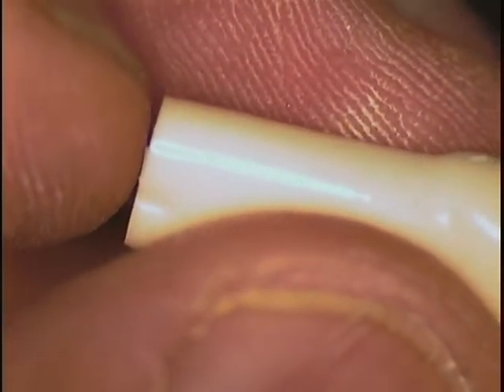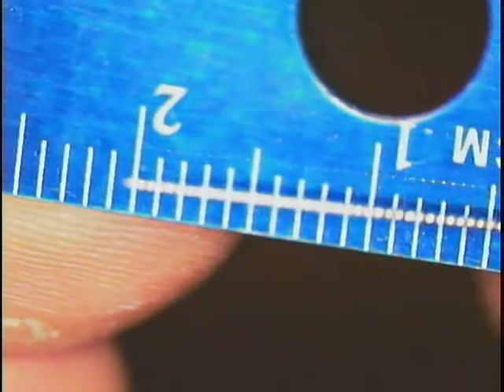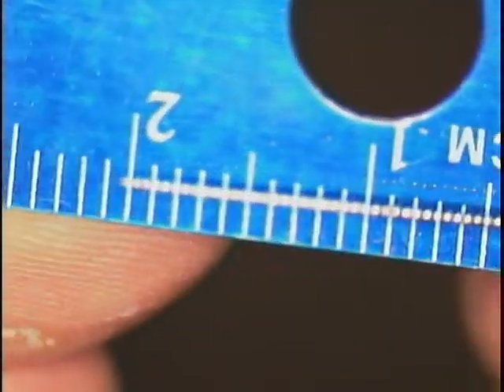Okay, so I'm out the end, I pull it back, I measure it, that's my mark. I take my ruler, and I'm on the metric side, right? And I'm going to measure, looks like 20, exactly 20. So I'm going to take 20 and I'm going to call my buccal 19.5. Okay, so my buccal working length is 19.5. Yours might be 19. It may be 18 and a half. I don't know. All these are a little different, so that's something for you to discover.